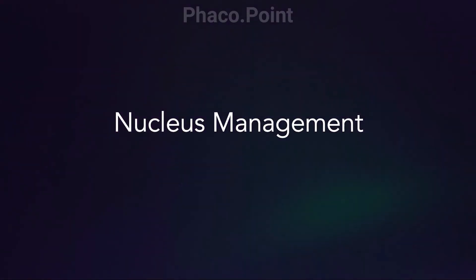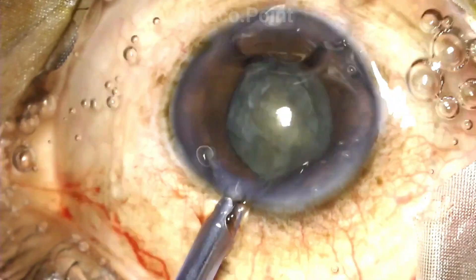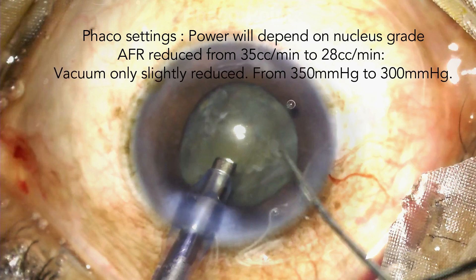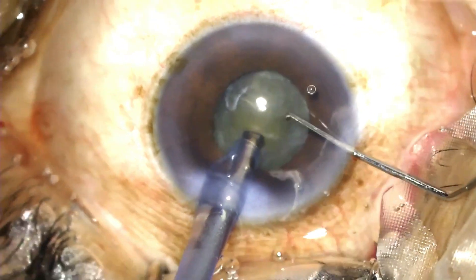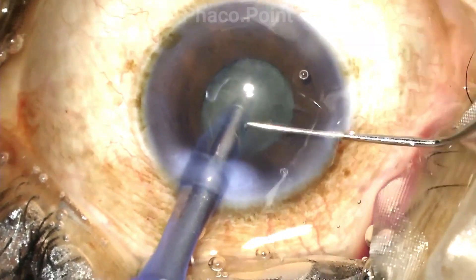Let's now move to understanding the various considerations in nucleus management of a small pupil phaco. We need a phaco power which is proportional to the density of the cataract — that phaco power doesn't change whether your pupil size is small or large; it is dictated by the density of the cataract. We reduce the flow rate significantly in these cases because we want a little more control. The vacuum is only slightly reduced. To me, the best technique for nucleus emulsification is the direct chop technique. In a small pupil phaco, since you need to work within the central 3 to 4 millimeters — the only visible area — no other technique would work as well as a direct chop.